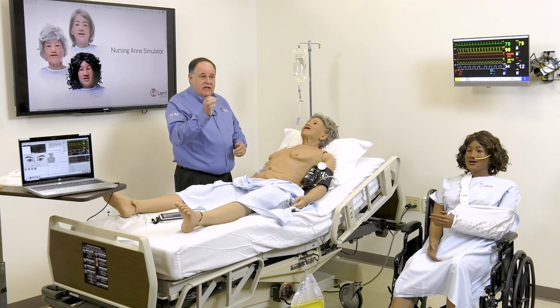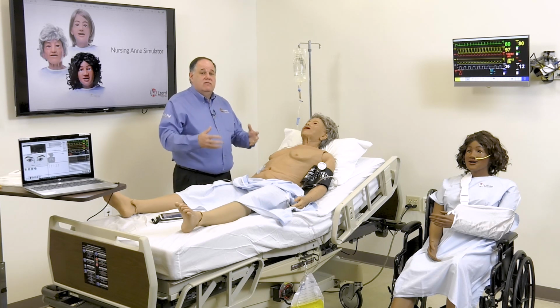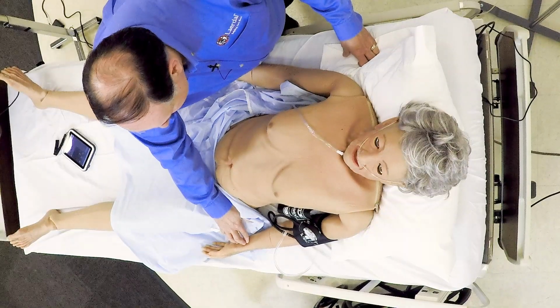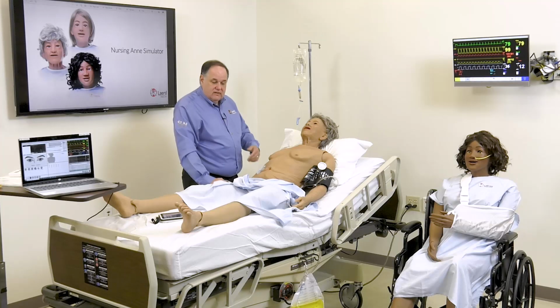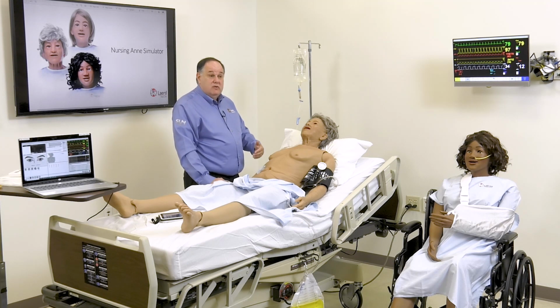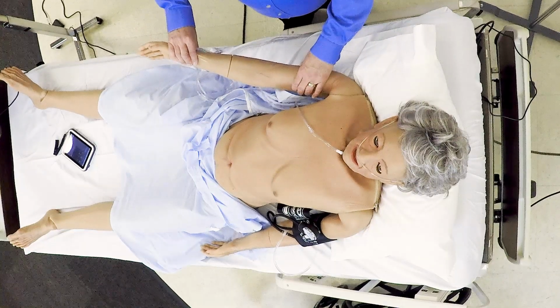So again, it allows you to take a traditional IV catheter, pass it, secure it like we have here, and then manage it appropriately, again, with the correct volume and rate. So really important. She also has pulses on her arms bilaterally, so we're really excited about that as well. Our previous nursing simulator didn't necessarily have pulses on both sides, but our nursing simulator now has pulses on both arms, and has both brachial and radial pulses, so that's exciting.